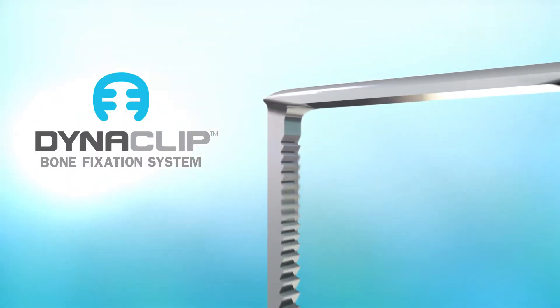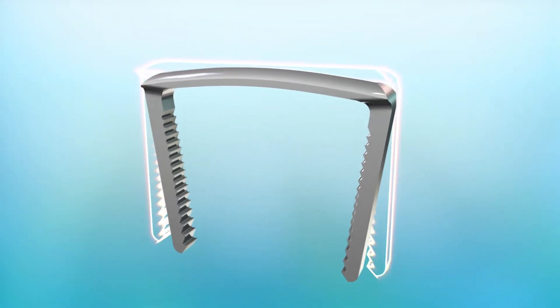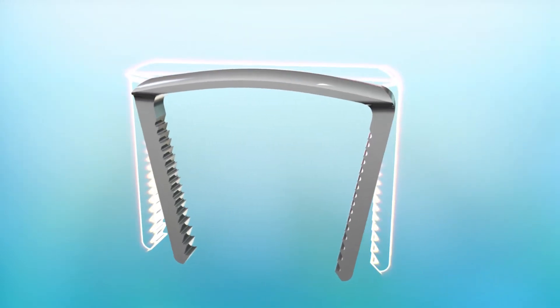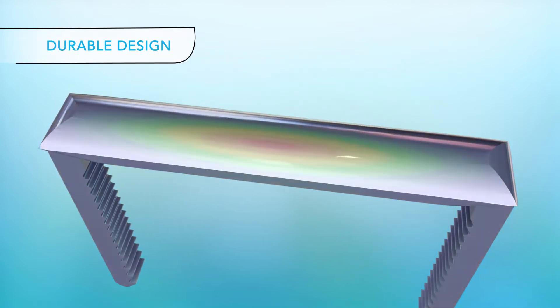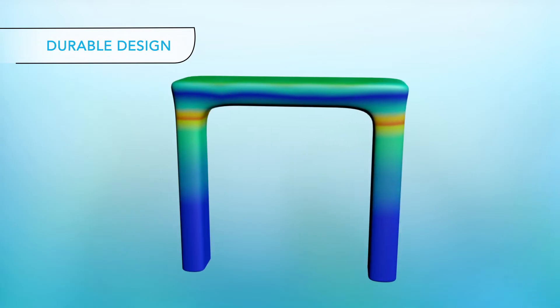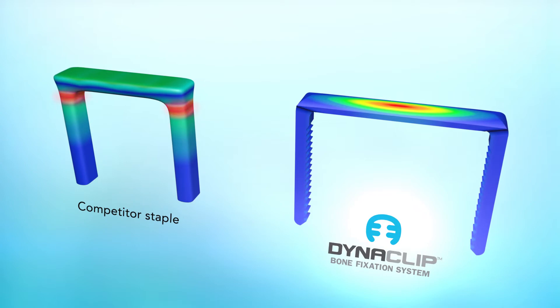MedShape's Dynaclip compression staple is made out of superelastic nitinol, allowing for instantaneous dynamic compression upon deployment. The Dynaclip's unique, robust design exhibits next generation strength compared to other nitinol staples by eliminating strain concentrations at the corners.